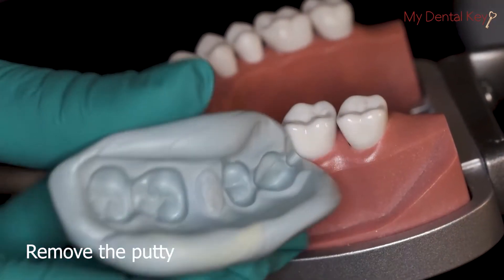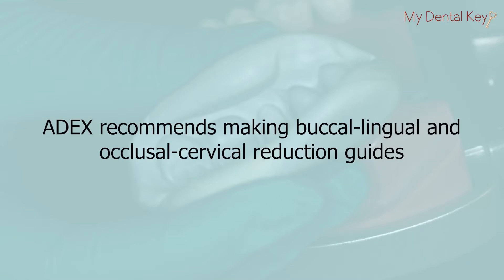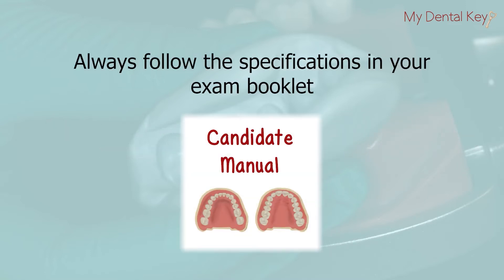Remove the putty and section the indices. ADEX recommends making buccal-lingual and occlusal-cervical reduction guides, but you can make as many as you would like to help with checking reduction from multiple angles. Always follow the specifications in your exam booklet for the reduction guides.